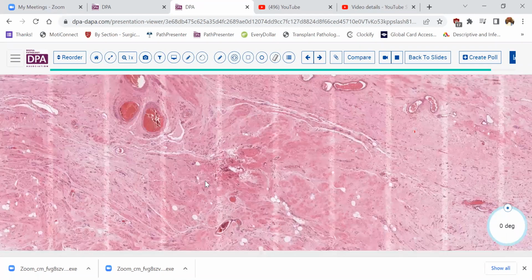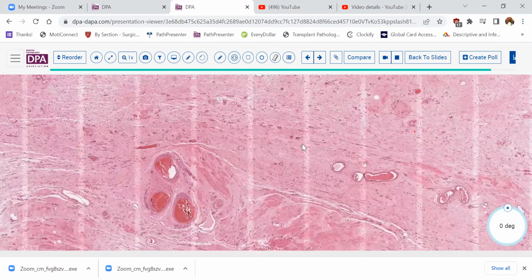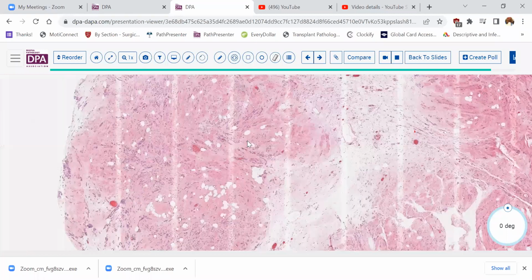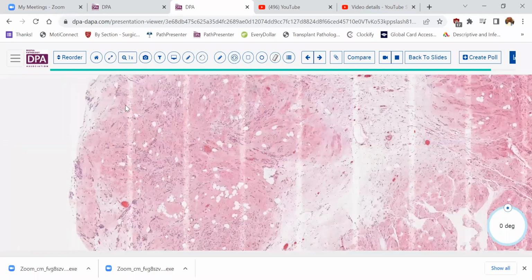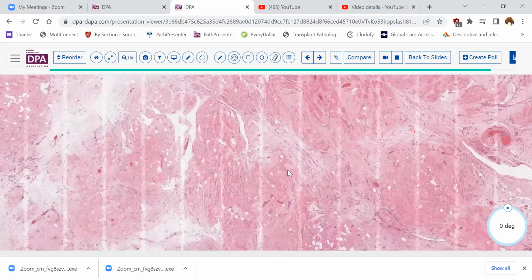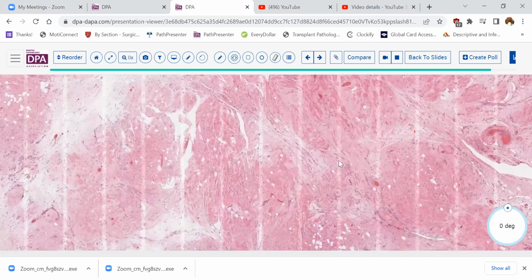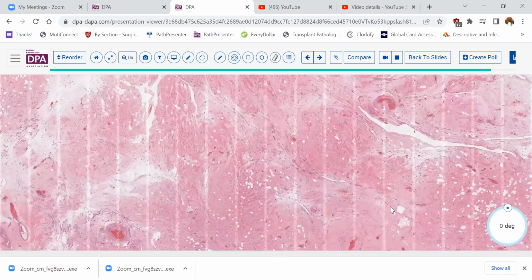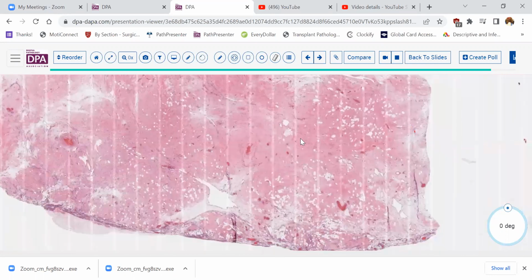And this is not usually a diagnostic challenge, but it is an important thing to remember that this does have a small malignant potential. And in patients who have subsequently been found to have liposarcomas in the uterus, there has often been one of these type of lesions as the underlying or related entity that was present in that uterus.